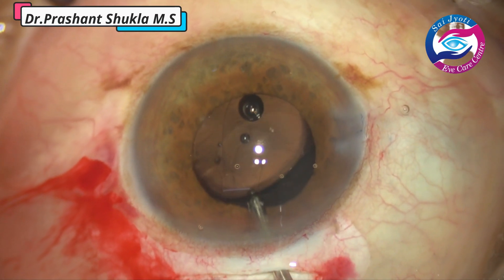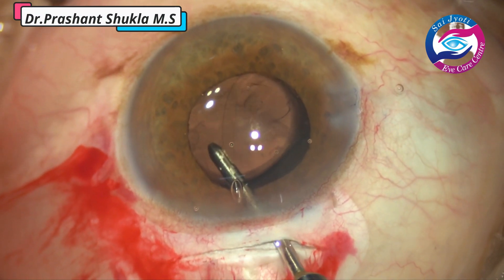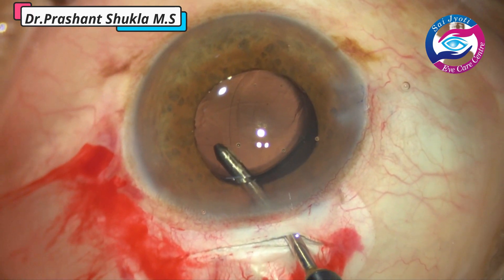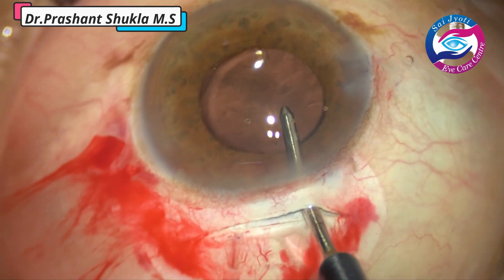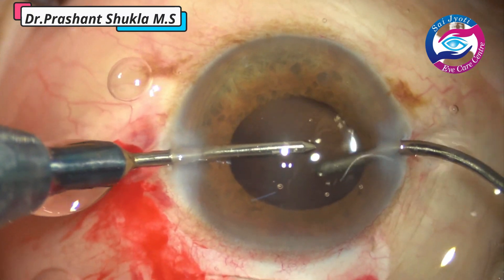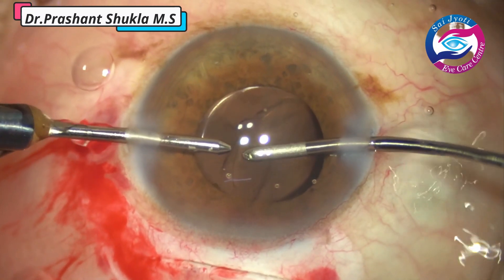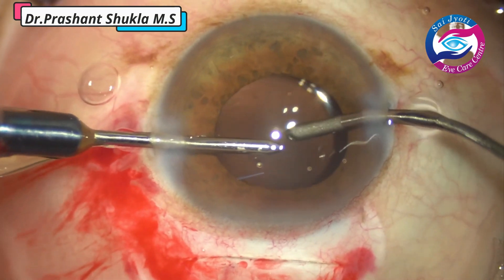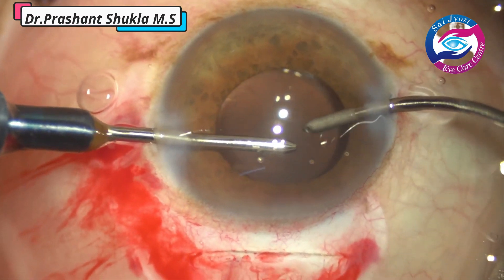Now it is time to remove the viscoelastic. The irrigation handpiece is used to go below the intraocular lens and, just with the irrigation fluid, the viscoelastic behind the intraocular lens is flushed out of the eye. You should always make sure all the viscoelastic is removed to avoid postoperative intraocular pressure spikes. Then both handpieces are used to remove the viscoelastic sticking to the anterior surface of the IOL and in the anterior chamber. Vacuum is 300, it is a venturi-based machine, and the bottle height is kept at 90 cm.